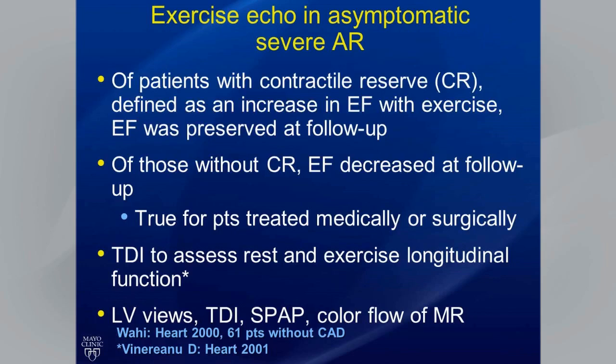Tissue Doppler imaging can also be used to assess rest and exercise longitudinal function, and it might be helpful to evaluate views of the left ventricle in particular, also tissue Doppler imaging, systolic pulmonary artery pressure, and even color flow assessment of mitral regurgitation.